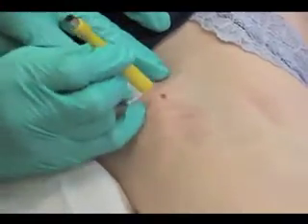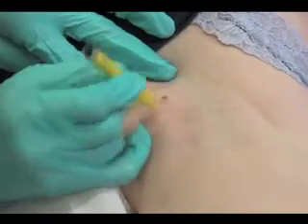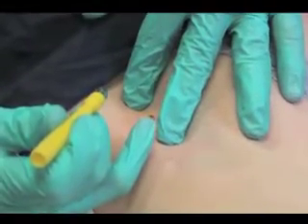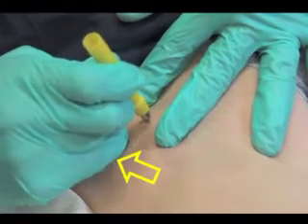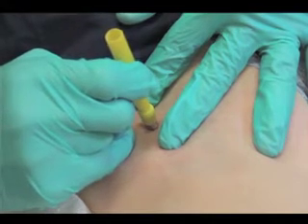To allow for the most complete sampling of pigmented lesions, it is useful to make an imprint around the lesion with the back of the punch before performing the biopsy. This imprint serves as a guide for centering the lesion in the punch. This initial imprint need not center on the lesion perfectly. Stretch the skin perpendicular to the skin tension lines, which results in an elliptical wound after the punch, minimizing puckering once sutured. Hold the punch in your hand and place the fifth finger of that hand adjacent to the lesion for stability. Position the punch over the lesion; for pigmented lesions, use your imprint as a guide.